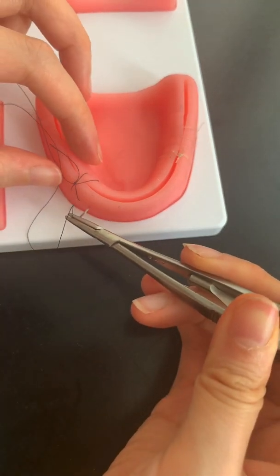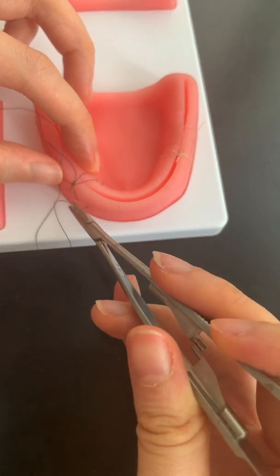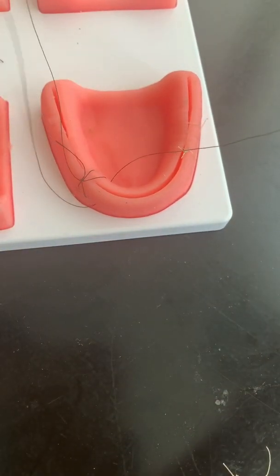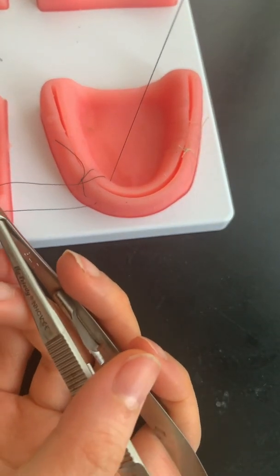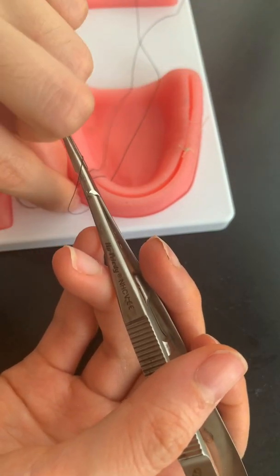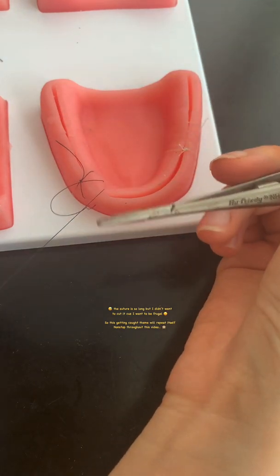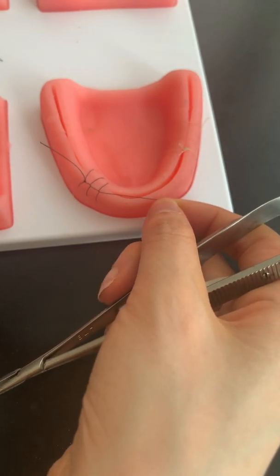So let's go same depth out and about the same depth. You pull it, keep this through, put it through. It's so long and it's just getting caught on everything. And see, it's starting to look pretty.